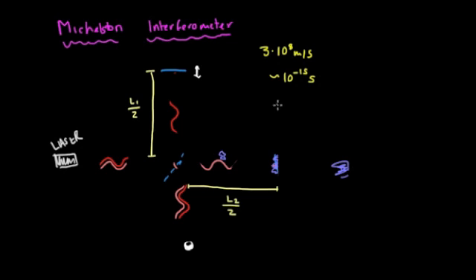And that's really fast, and so that, as you can imagine, might be a little bit expensive. So there is another solution to this problem of localizing the tissue. Remember, we're looking at monochromatic coherent light, so just red light in all of these examples. What if instead of monochromatic light, we include maybe just a little light that's not quite red?